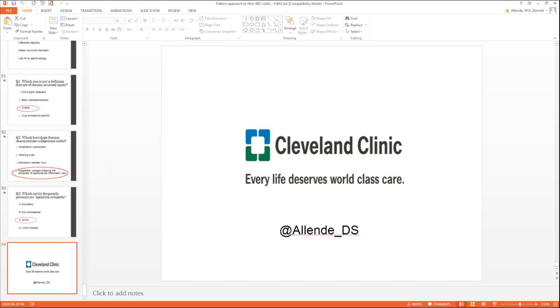So I think there's not really a hardcore rule on how to study these cases. It's case by case and depends on the level of suspicion. I think doing it on every case, maybe just because you see a neutrophil, is not worth it. You're going to have a lot of negative results.